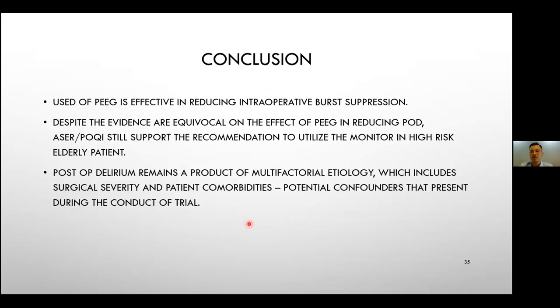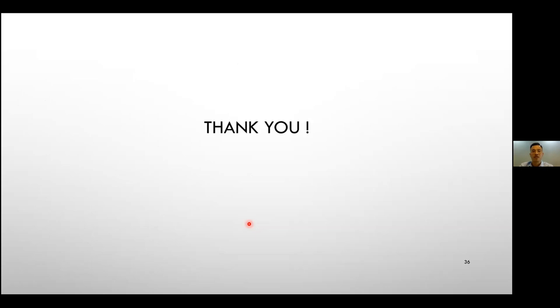To conclude, the use of processed EEG is effective in reducing intraoperative burst suppression. And although the evidence is equivocal on the effect of processed EEG in reducing post-op delirium, the American Society for Enhanced Recovery and the Perioperative Quality Initiative still recommend using this monitor in high-risk elderly patients. I would also like to stress that post-op delirium remains a product of multifactorial etiology, which includes surgical severity and patient comorbidities, which act as potential confounders that are usually present during the conduct of a trial. With that, I thank all of you for listening.